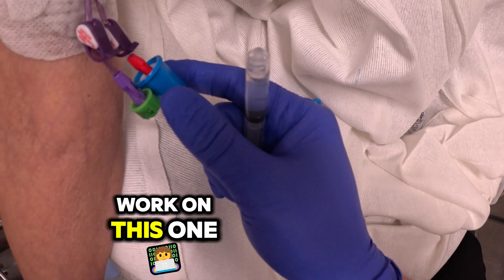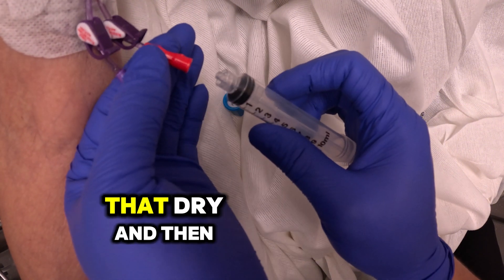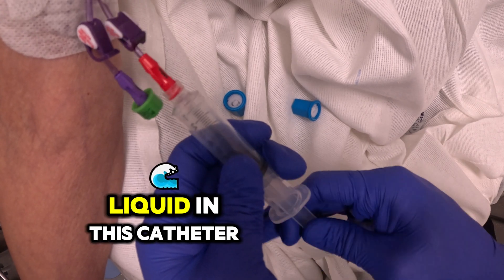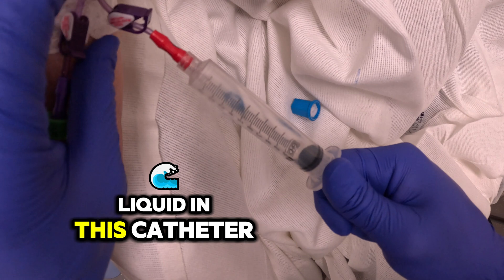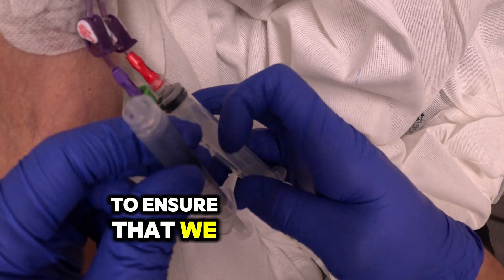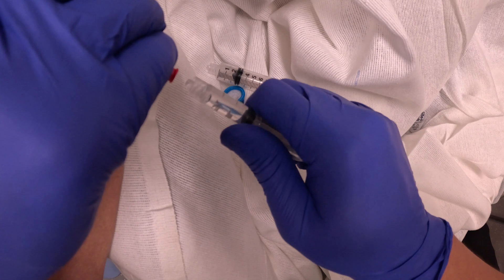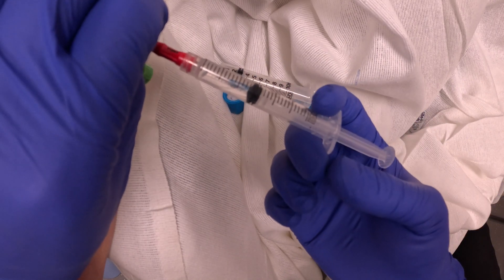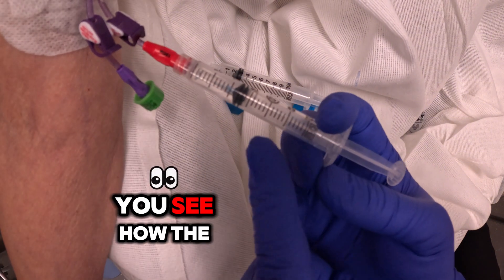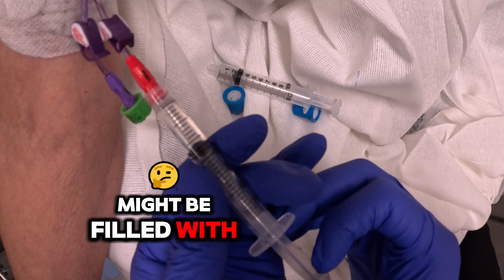Now we've got to work on this one. Maintaining ANTT, I'm going to take an empty 10 cc syringe, let that dry, and then apply negative pressure because I want no liquid in this catheter. I'm going to clamp the line to ensure we still have a vacuum in place, then apply it — and hopefully you'll see there it is. Do you see how the vacuum sucked in the volume? It only sucked in 0.5, so almost half of this catheter might be filled with a clot.